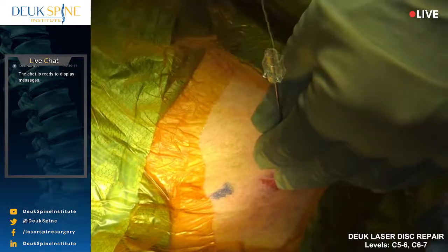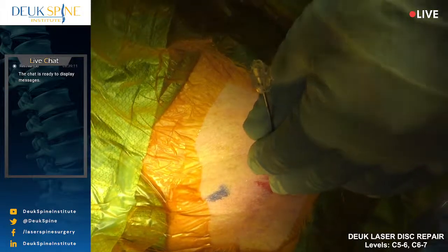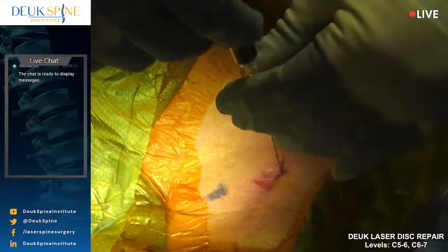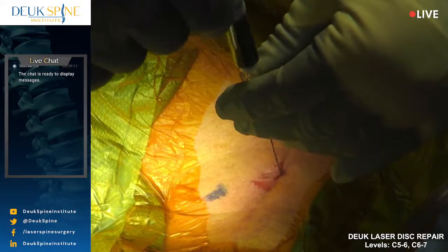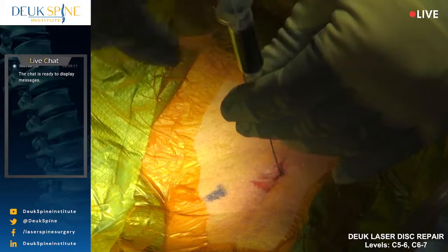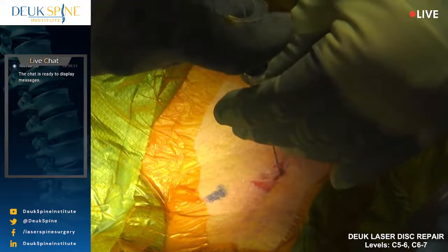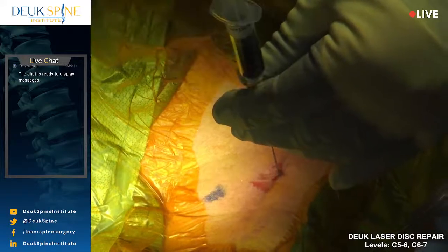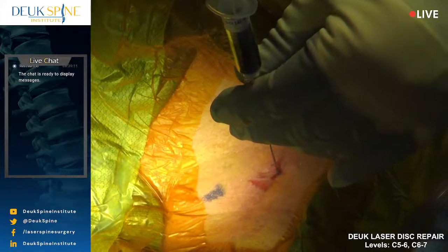All right, so the surgery is done through the front of the neck. It's endoscopic. We'll be using a 4mm incision, the smallest surgical incision in the world, to do a discectomy through the front of the neck. We're going to do this endoscopically. I need a pull and a shot.